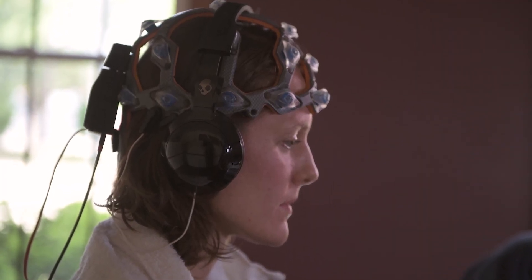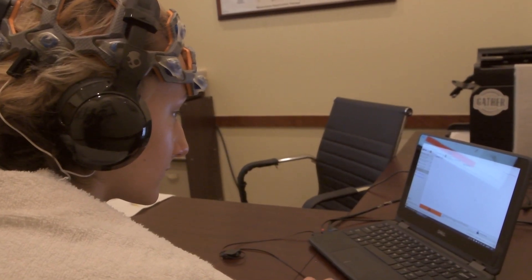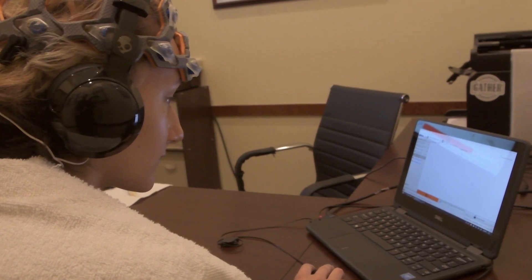It's easy to do. It takes about 20 minutes to do a total scan in the office. You can have somebody do it for you, and you can sit down with a patient and explain to them real-time with their reports as a dashboard what's going on in their brain. The reason I think we're getting so much success with it is that patients are participating in real functional medicine testing.